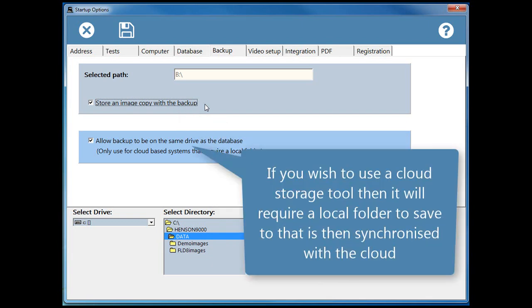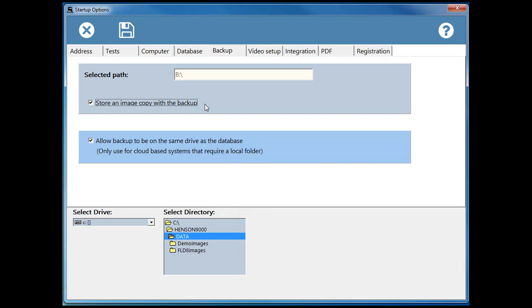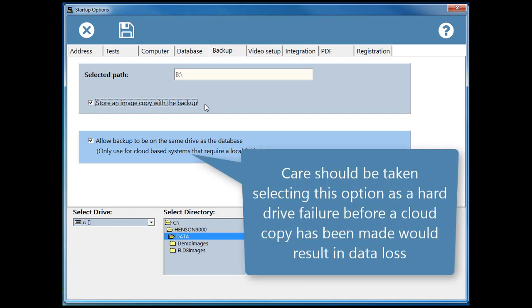If you wish to use a cloud storage tool, then it will require a local folder to save to that is then synchronized with the cloud. Care should be taken selecting this option, as a hard drive failure before a cloud copy has been made would result in data loss.